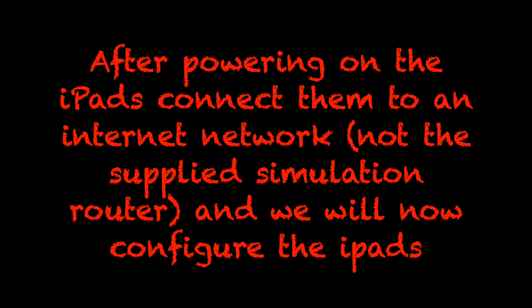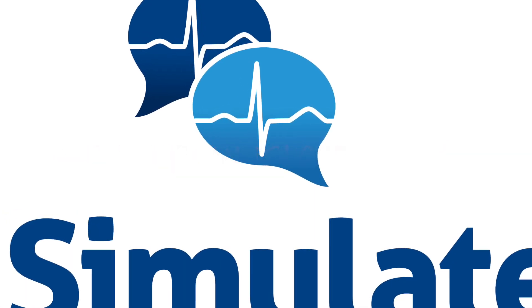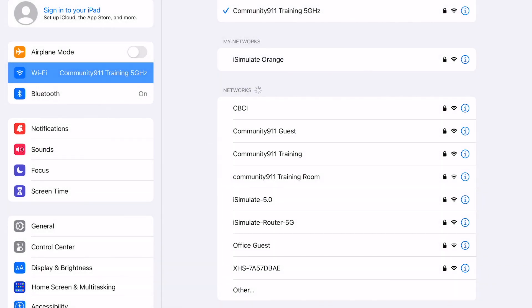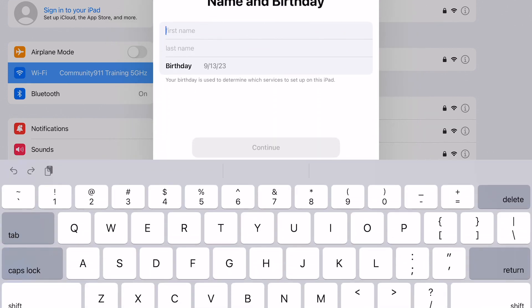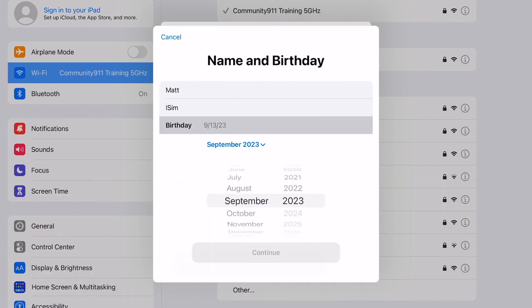After we've powered everything on, we're going to connect them to an internet connection so we can begin to create our iCloud account and log into our license. On both iPads, you'll need to connect to an internet connection where you can access the World Wide Web — this may be your home or office network. Once connected, the iPad will prompt you, or you'll need to tap on the top left corner to create an Apple ID. We recommend you create a unique Apple ID for your training organization and not use your personal information on these devices. Please make sure to write down your birthday, passwords, and other question answers as we are not able to access this information.